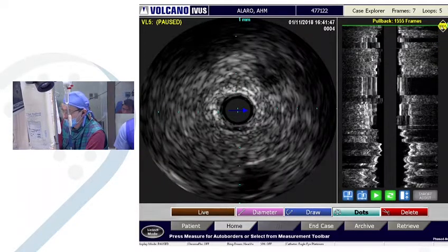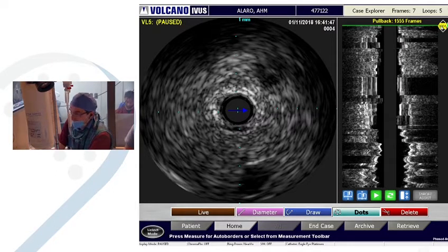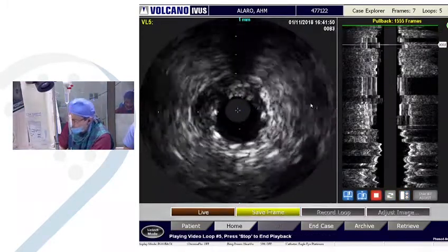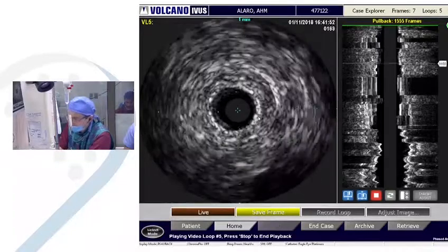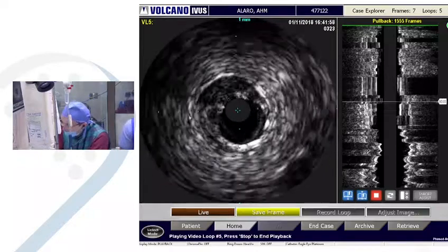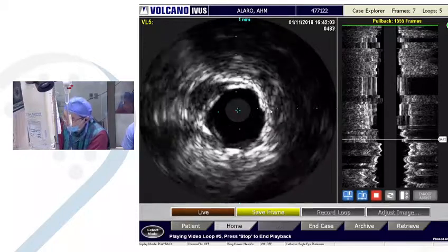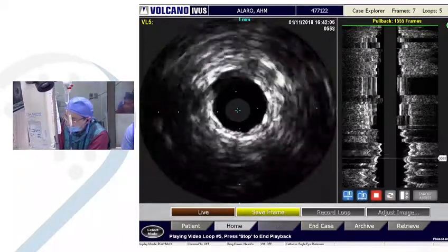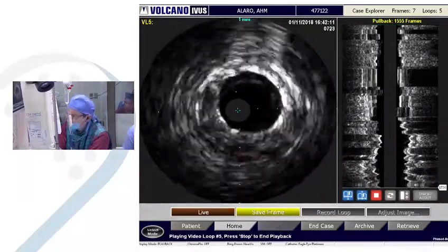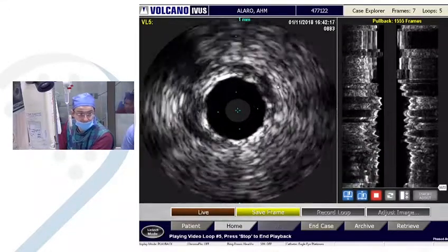Going back to the distal LAD, you see that landing zone was a very small target, 2 millimeter. And we don't see the lesion that needed to be stented finally, but more proximally in that LAD, the 2.5 stent was also too small. So we took a 3.0 balloon at that level. And the final idea is to now do kissing, circ and LAD.